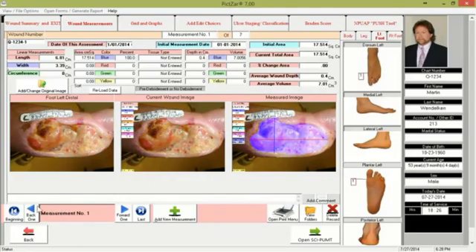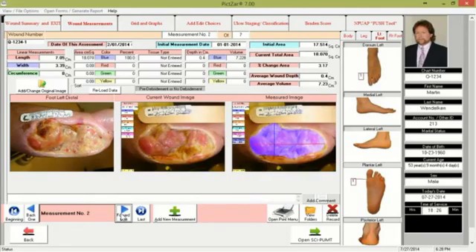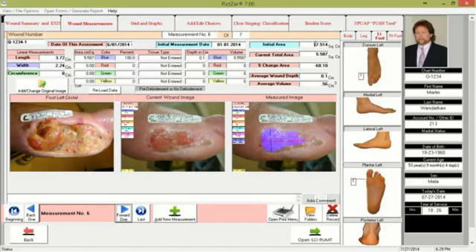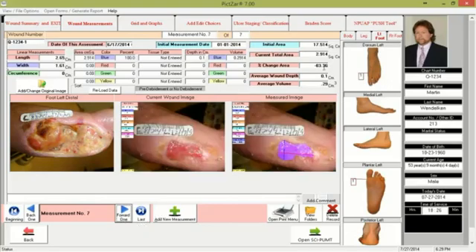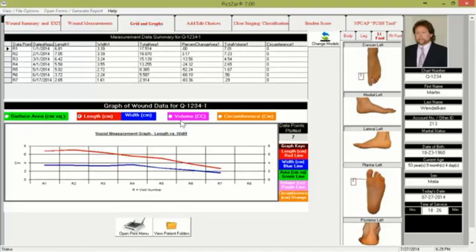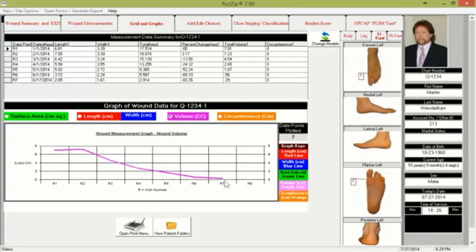You may also scroll through the wounds — in this case there are seven images and you're able to scroll back and forth. When the image is changed, the associated data changes along with it, including the percent change in surface area, the length, the width, the depth, and the volume if you had calculated those — all done by the computer. As mentioned, there is no typing here; the data is generated by the computer when measuring the image. The next tab is the grids and graphs showing the area, length and width, and volume graphs — all showing that the wound is progressing nicely towards closure.